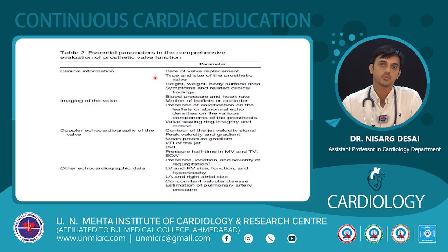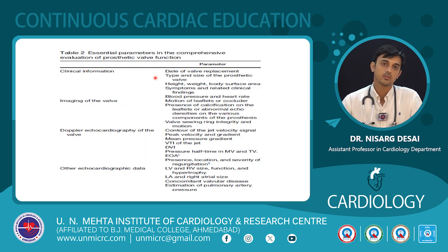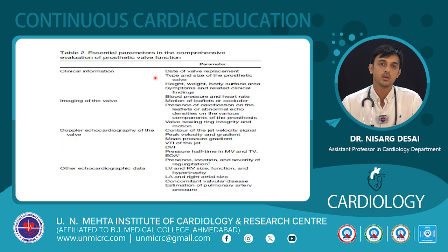Plus, if the blood pressure is very high, let's say if we have an aortic valve replacement and the systolic blood pressure is high, then the gradients across the valves can be falsely low. So it is important to know the blood pressure. So the date, the type of valve, what symptoms the patient has come with, the body surface area, as well as the blood pressure and heart rate are important parameters in the clinical assessment.